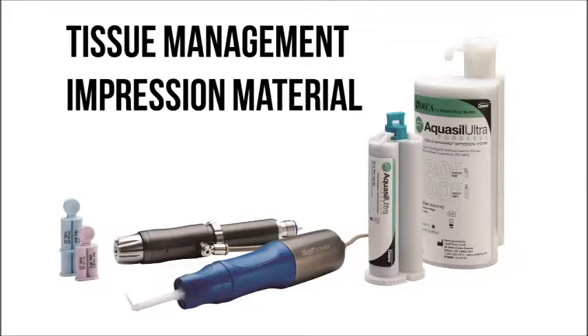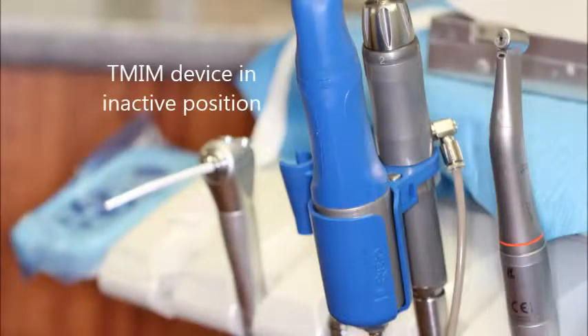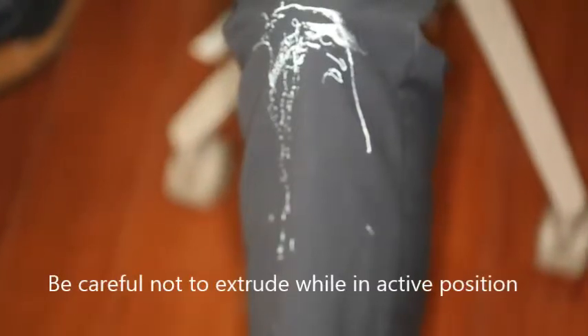Today we're going to be talking about the Tissue Management Impression Material System by Dentsply. This system comes with two parts: a regulator and a handpiece. They're both placed into a holster, which may be placed in an active or inactive position. Be careful while it's in the active position, because material can be extruded onto your clothing.